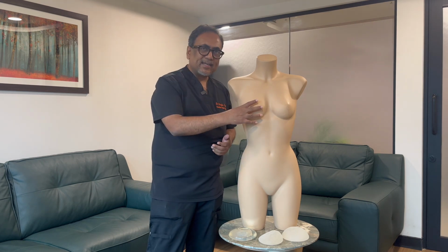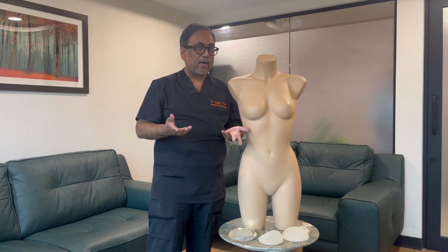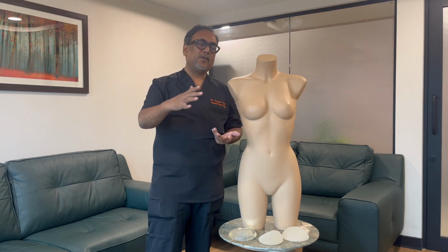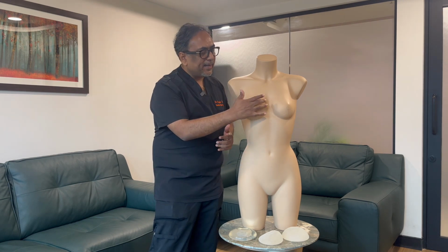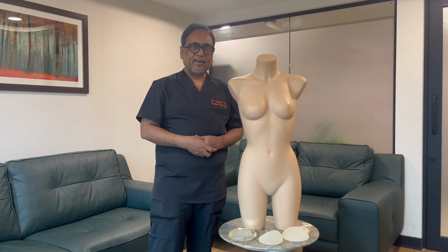If the patient likes it, that's the volume of the implant which is going into the patient. If the patient doesn't like it, either it is too big or too small. So the patient may opt for an implant which is either smaller or bigger. So this is understanding the patient's wishes, and then we keep the limits in consideration and go ahead with the perfect implant for the patient.